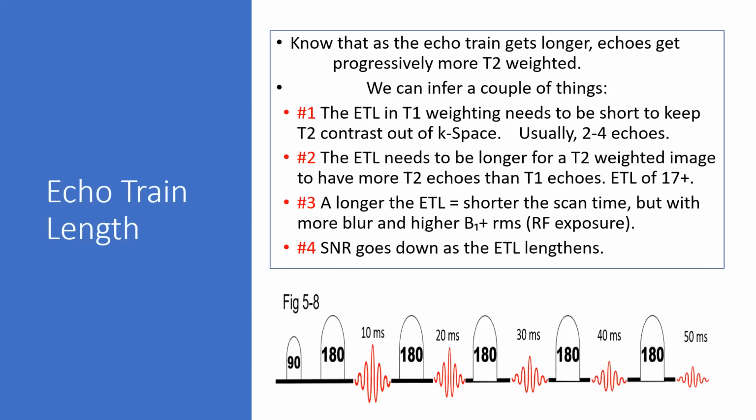And you're getting that by RF pulses, either echo trains or SAT pulses and things like that. So really what you're doing when you override the SAR and you do something, either increase the TR or drop your echo train or delete some SATs, right? Those are usually your first few that you go to. What you're doing is you're decreasing the B1 root mean squared, which is your RF exposure. So they could potentially, and be tricky, start to use either one of those terms, SAR or B1 root mean squared. They could potentially interchange those. So just be mindful.